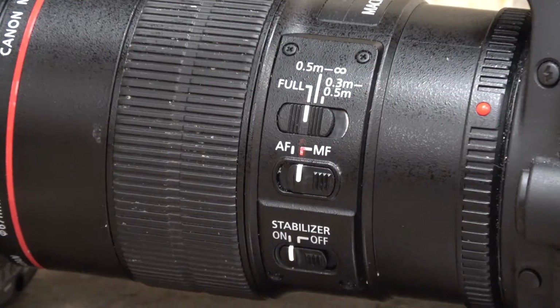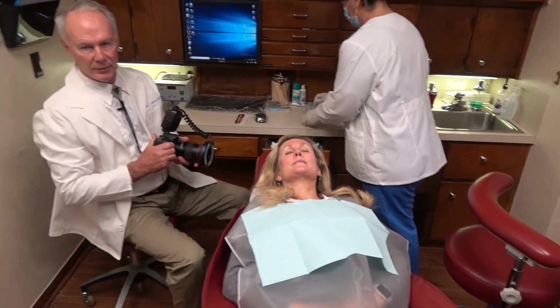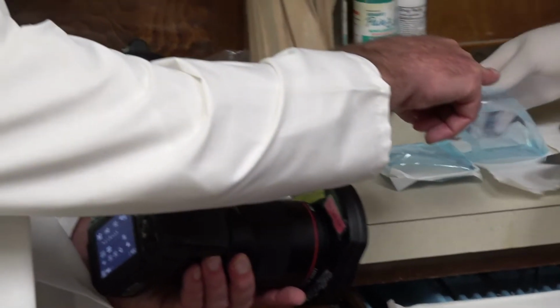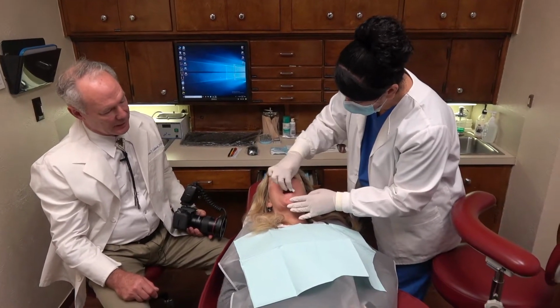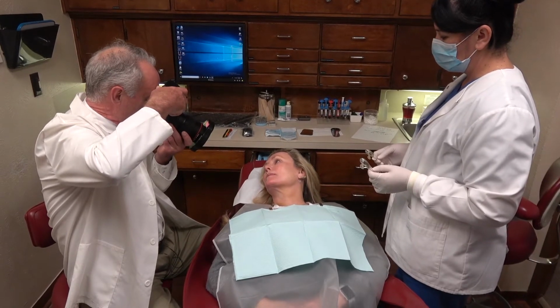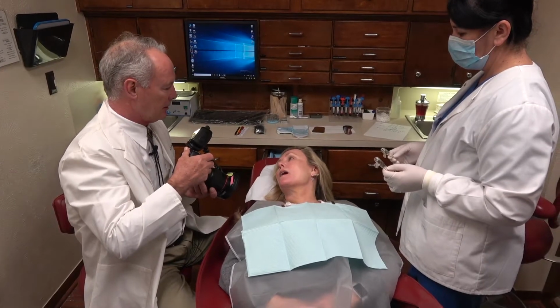Then I'm going to reset this button to M and this one to MF, manual. And it's very important that you have the right mirror system and retractors. So I like the single retractors right here, and we put Vaseline on the retractors and on the patient's lips. Louisa is going to place Vaseline on the patient's lips. Now this is just of the smile. Say big cheese, please. Cheese. Cheese. Now lick your lips and let your lips just hang. Just say, good.